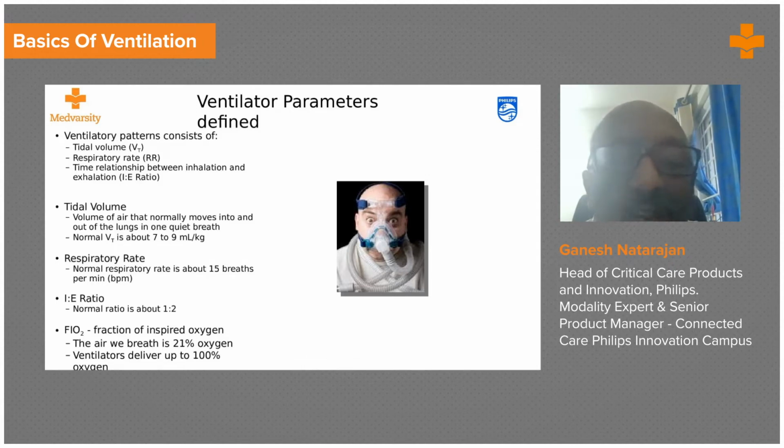The respiratory rate, which is also called frequency in some equipment, is the normal breathing rate of a patient. One respiratory rate equal to one inspiration and one exhalation. So normally we breathe at 12 to 14 breaths every minute. If we are having impending respiratory failure, there is a chance that the breath rate increases to compensate. So the equipment in certain modes, you set a breath rate.